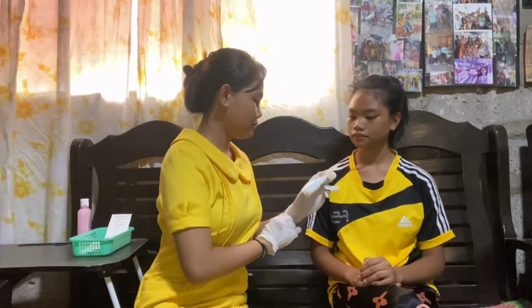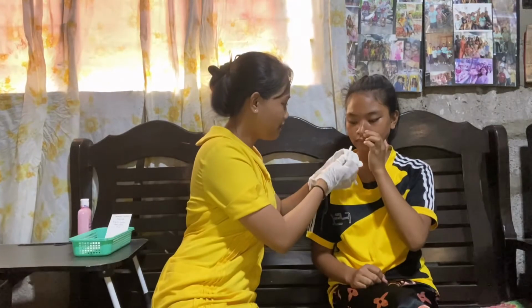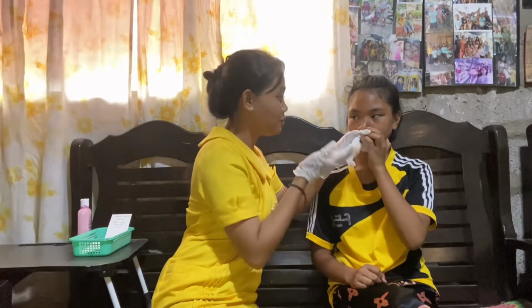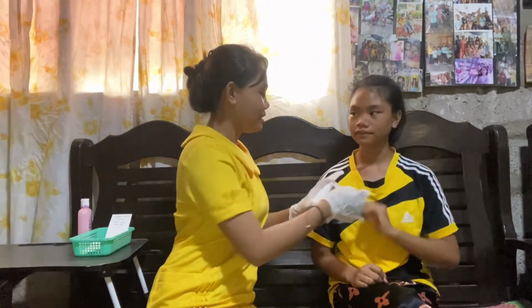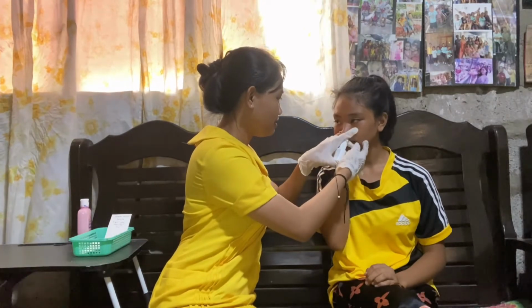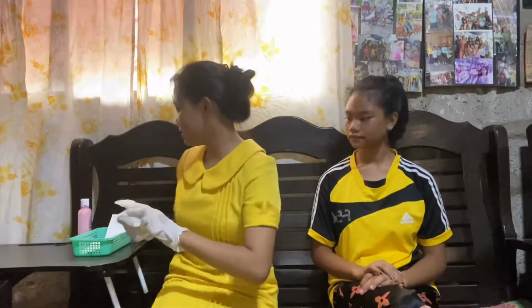Ayan. So, hold nyo po yon and then tingala po kayo. And then, dahan-dahan pong baba. Baba po. So, 1. Spray ko na po. 1, 2. Inhale nyo po siya after kung may spray. 1, 2, 3. And then, okay na po. And then, sa kabila naman po, tingala po muna. Mababa na po. Ayan. So, 1, 2, 3. Spray ko na po. Inhale nyo po. Ayan. Okay na po.